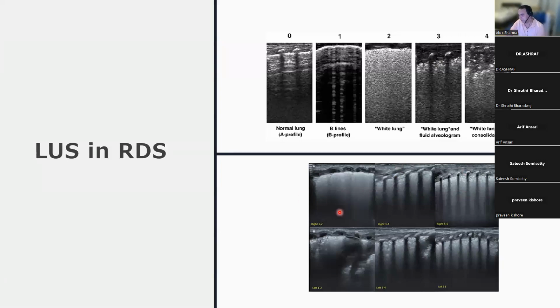So I would look at these images and clinically correlate, because if this baby is in 23% oxygen and you use Brat's score, anterolateral scoring, then you'd give this baby a 2 for here, possibly a 3 for here, which would mean that if this is R1, R2, he gets 4 plus 3, 7, 14. So eventually this baby will need treatment. But the posterior regions are going to be bad because of atelectasis anyway.